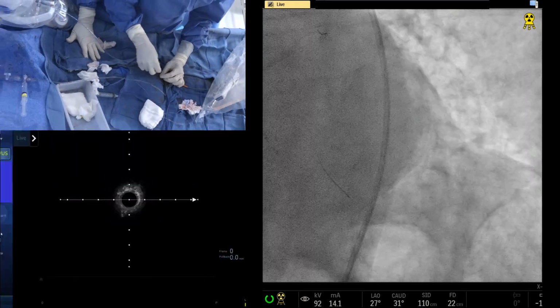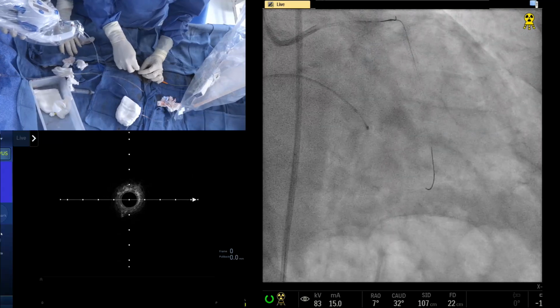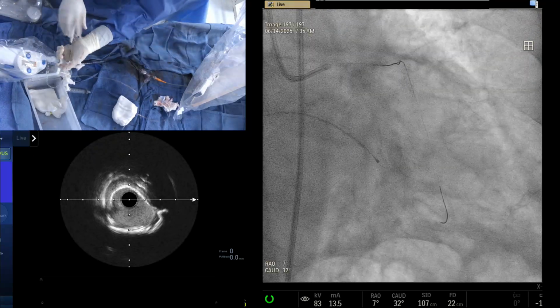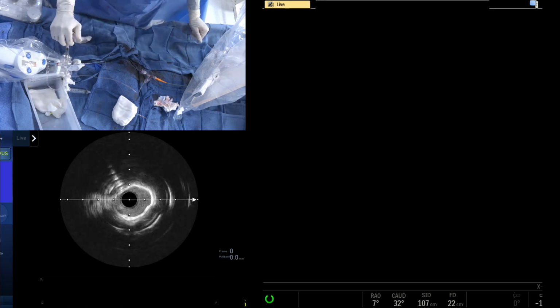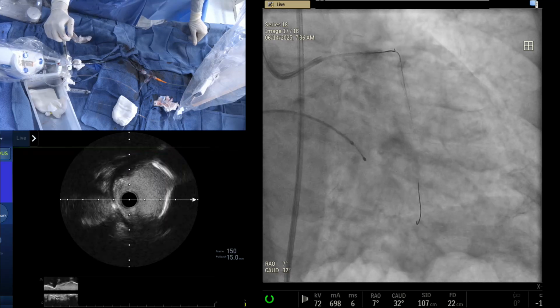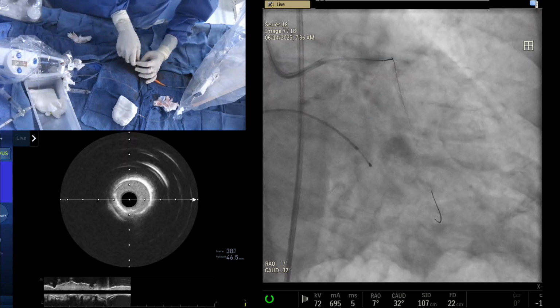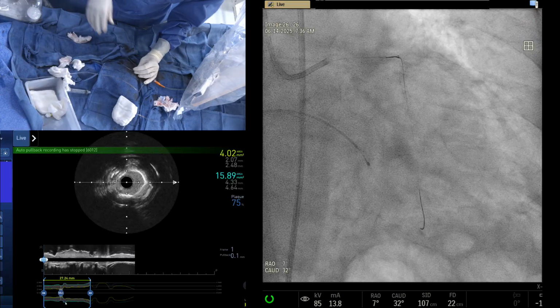Okay. Yeah, go to RAO a little bit. Straight RAO? Good. Who is there? Asif? Okay. Go live. Let us see. Okay, that's a left main. Mm-hmm. No, distal left main is definitely there. What about the proximal LAD? That's the question. Move it from distal to proximal slowly.